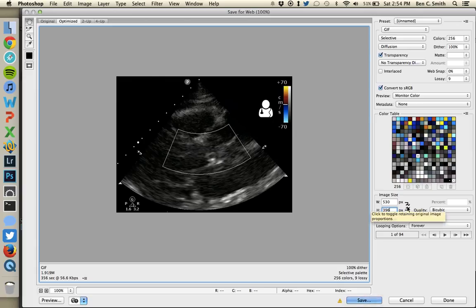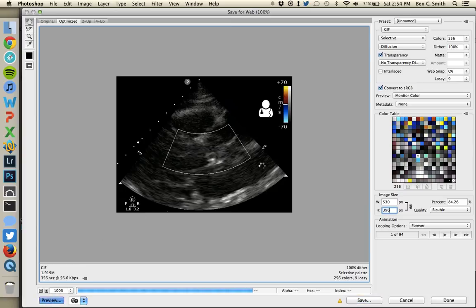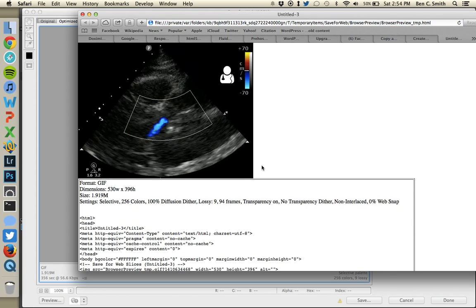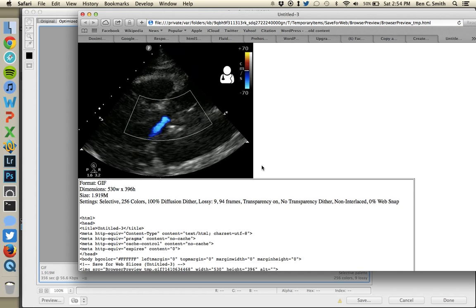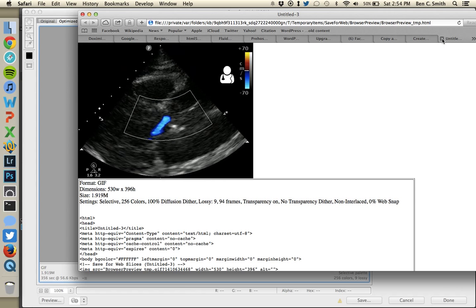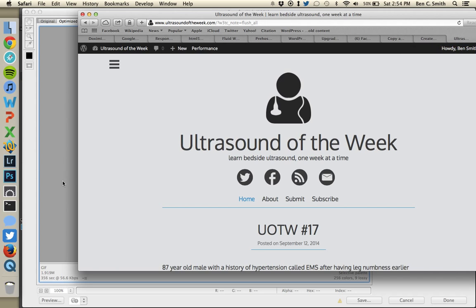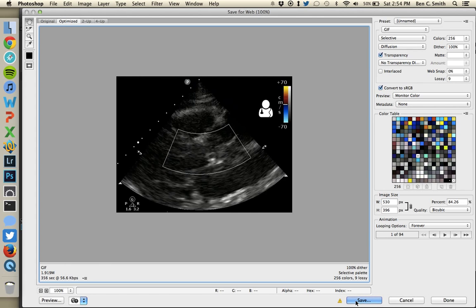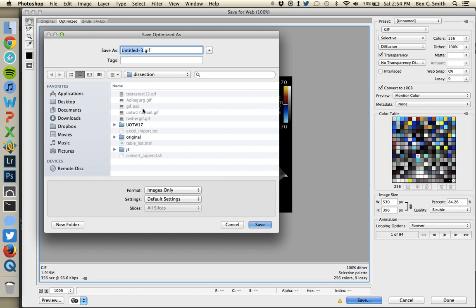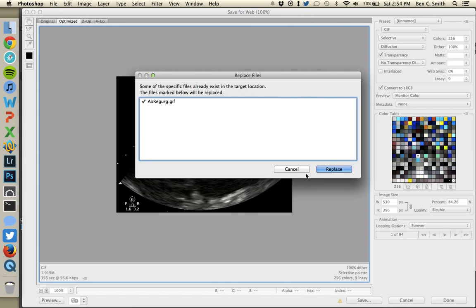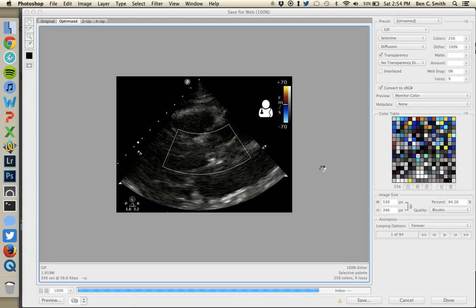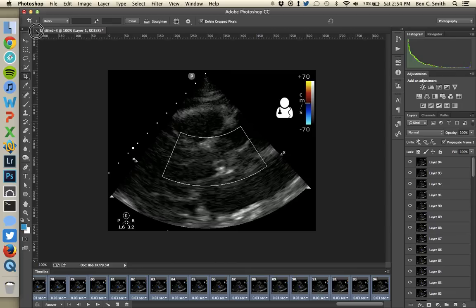Make sure the chain link is on so proportions are maintained. Also confirm that 'Forever' is selected for looping. If you want to preview how this looks in a browser, click Preview. It looks pretty good — this is about what I posted to Twitter yesterday. Once satisfied, click the Save button and name your file. I'll call this 'aortic_regurg.gif' and hit Replace since I had one from earlier. And it saves.